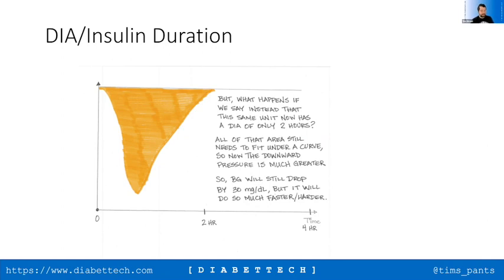If we've got anybody in the chat who's using a DIA, insulin duration, of less than 5 hours, can you please mention it? Or you can speak up on the Zoom as well. Either works. It would seem that we don't. No response on that, which is a good thing. Pleased to hear that. So it does mean that everybody has a decent insulin duration in their system.